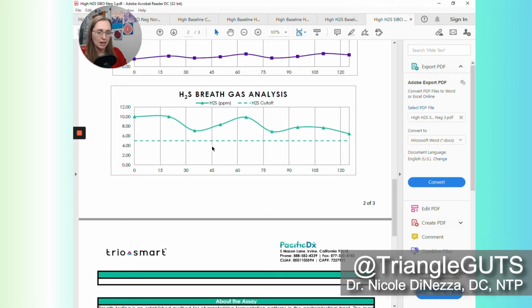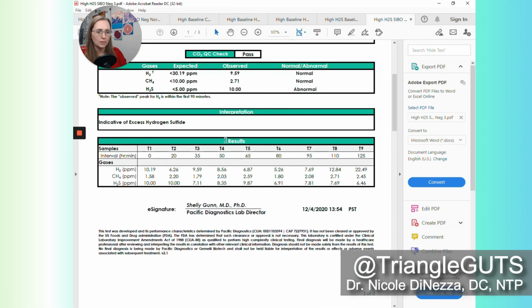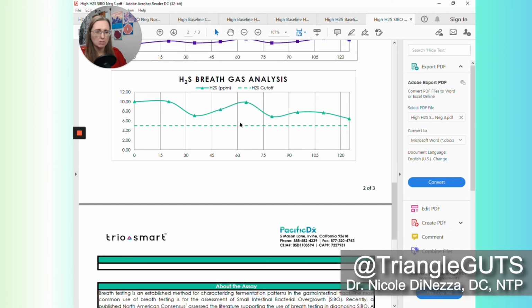And then yet again, we have another great example of an elevated hydrogen sulfide baseline. And then it stays persistently high, although it wobbles a little bit. It stays persistently high throughout the entire duration of the test. Now again, let's look at sample number 3 and sample number 5. You can see that hydrogen sulfide in this case goes from 7.1 up to 9.87. So we're climbing up maybe a little bit shy of 3 parts per million. So again, you could say that maybe there's a bit of a presence of a hydrogen sulfide producer in the small intestine. But again, the difference between the low point and the high point is not crossing that 5 part per million threshold. So technically speaking, this would not get the diagnosis of SIBO.